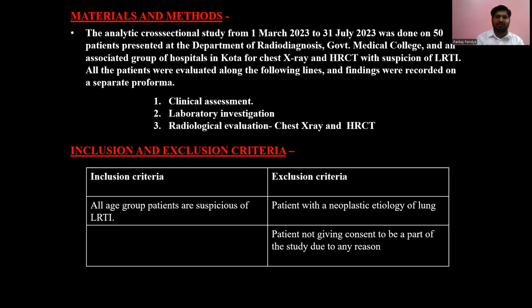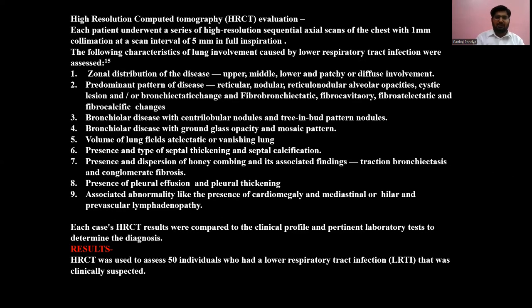Inclusion and exclusion criteria. Inclusion criteria: all age group patients suspicious of LRTI. Exclusion criteria: patients with neoplastic etiology of lung, and patients not giving consent to be a part of the study for any reason. HRCT evaluation: each patient underwent HRCT, high resolution sequential axial scan of chest with 1 mm collimation at a scan interval of 5 mm in full inspiration.